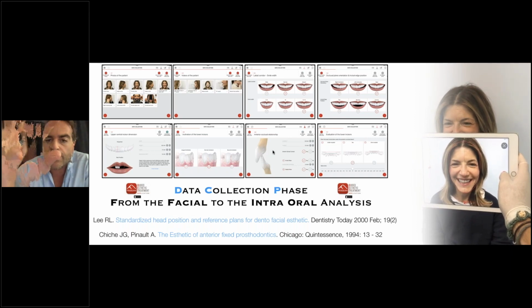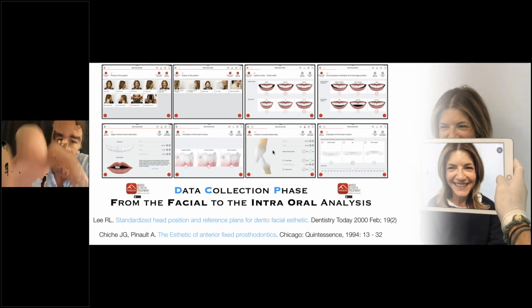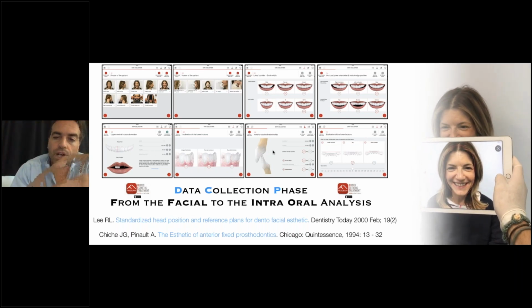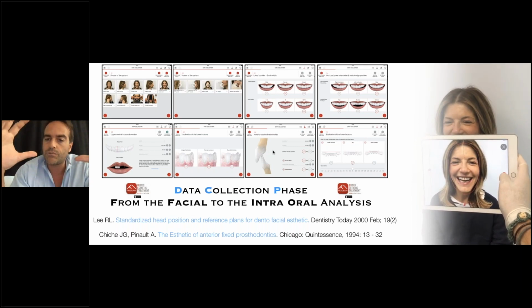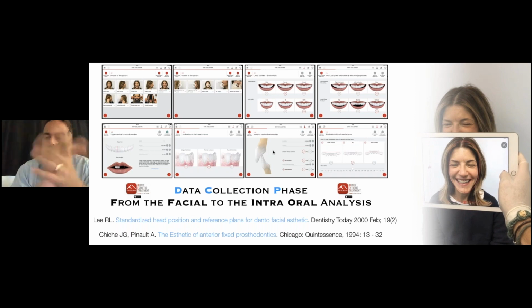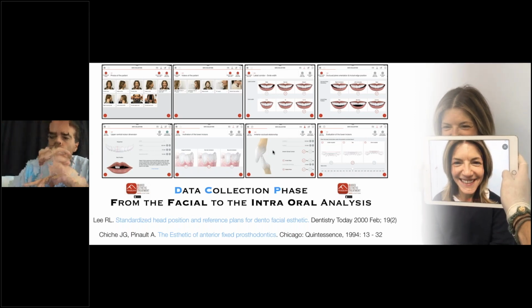We can have information, and we can add videos and pictures inside this application in order really to have the big picture of the patient, the big diagnostic picture of the patient in front of us, and share it with our lab, and then create our treatment plan decision making.